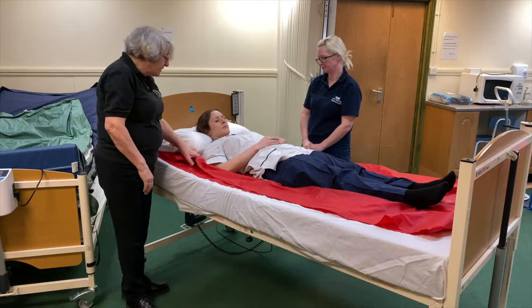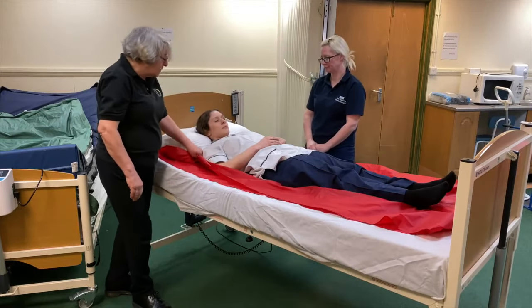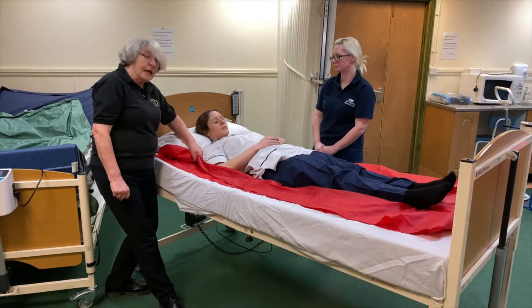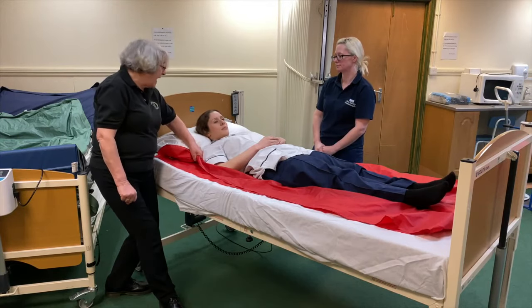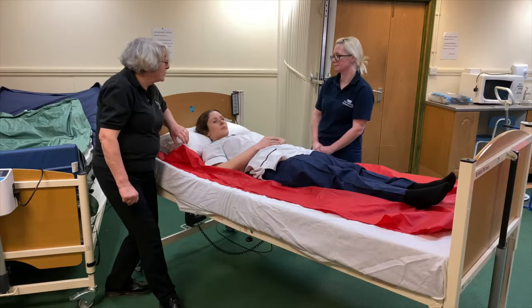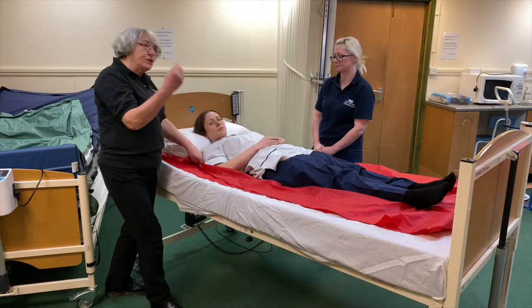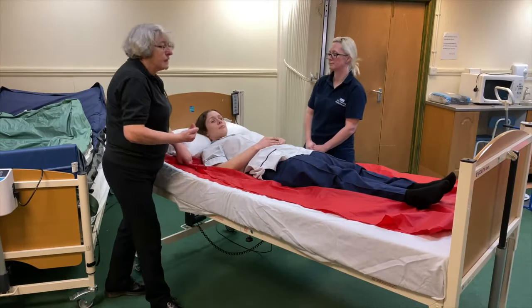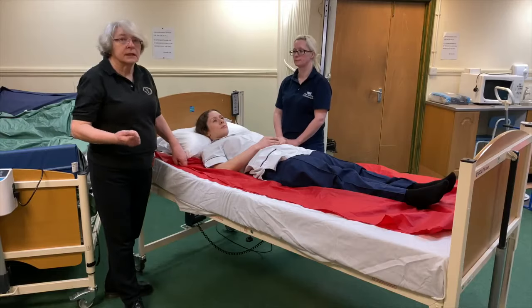Now the other reason that my hand is here by Alice's shoulder is because my elbow is now above her head, and therefore the first thing that will knock is my elbow. So it's efficient and it's safe. Supine slide up the bed. Thank you.